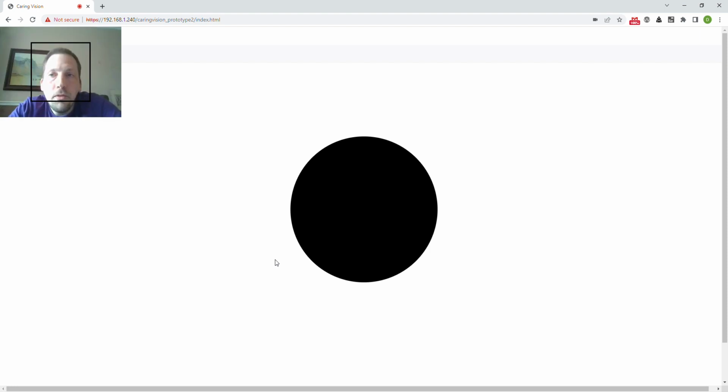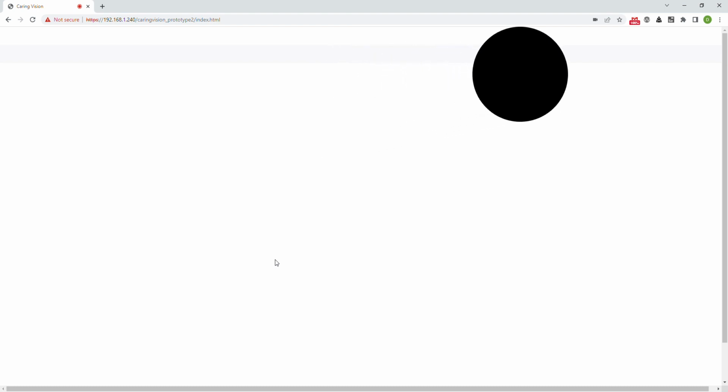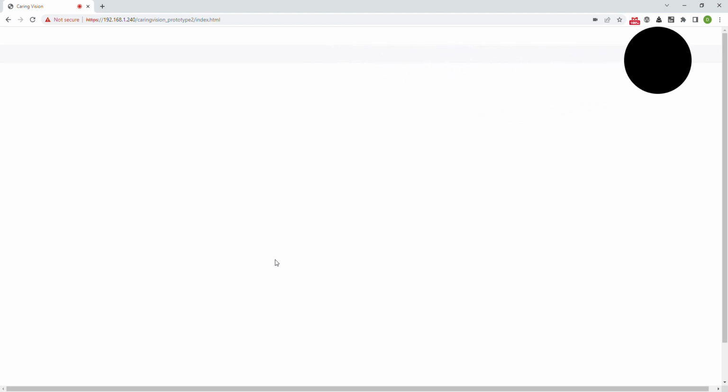In a moment, a video screen will appear in the top left-hand corner of the screen, and you'll be able to see me again. This is important for the assessor to make sure that the eyes are lined up in the center of the screen. If they're not, the computer will tell you. It's still loading. The border is currently black, and now the application is monitoring my eye movements as I follow the black dot around the screen.